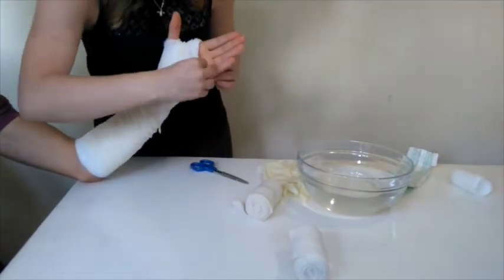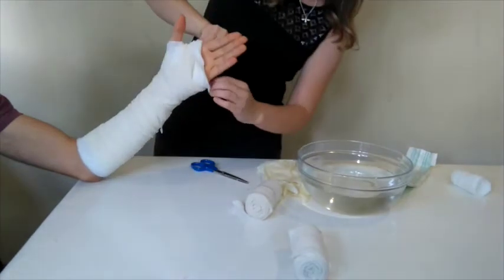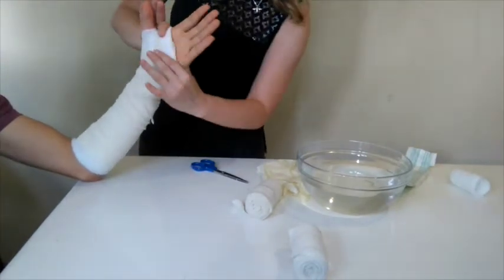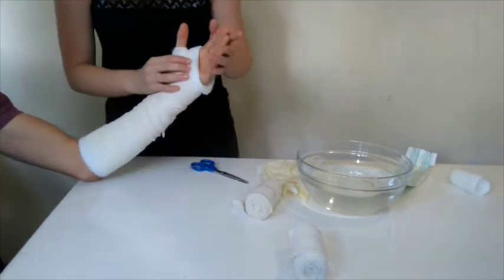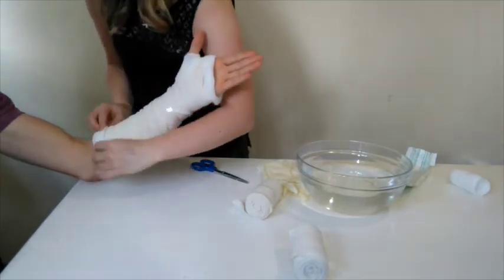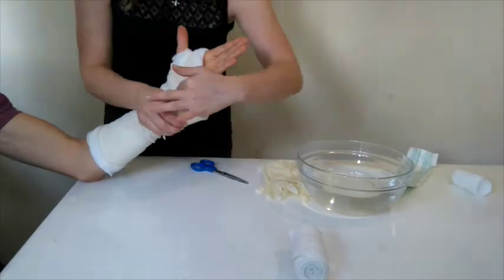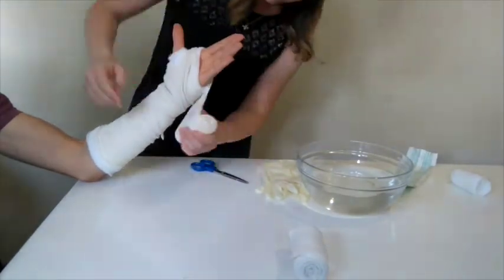Fold over the excess padding before applying the next layers. It is vital to note that for flexion of the MCP joints, the plaster of Paris must end proximal to the second palmar crease — if in doubt, check. Apply the second layer of plaster of Paris in the same way.